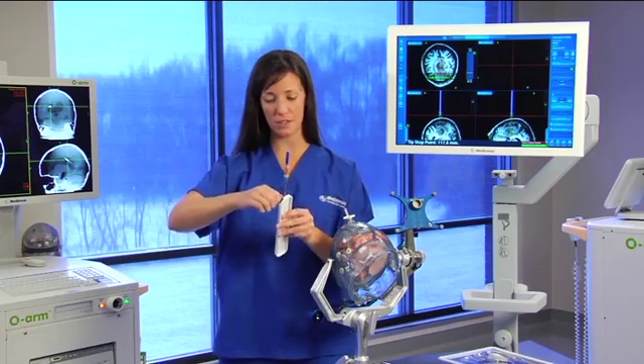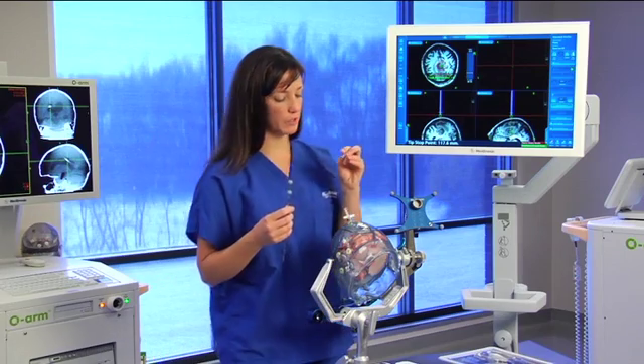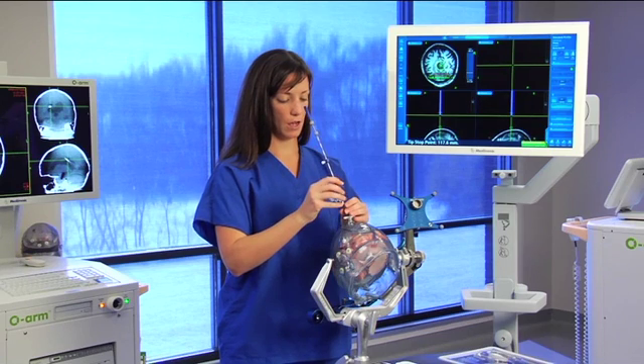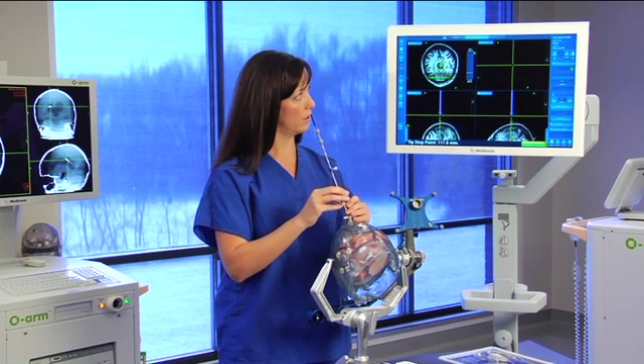I'm going to tighten down the stop. I'm going to select the 2.2 millimeter reducing tube that fits right down that guide stem, and then pass my biopsy needle right down.